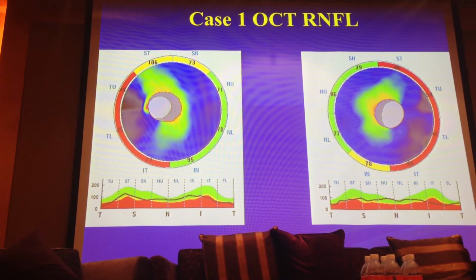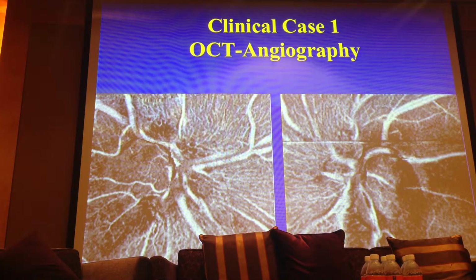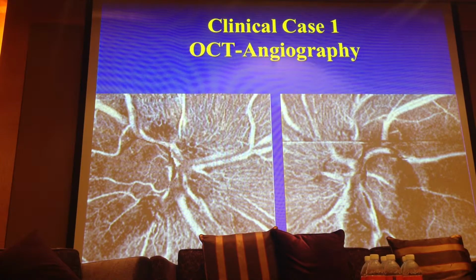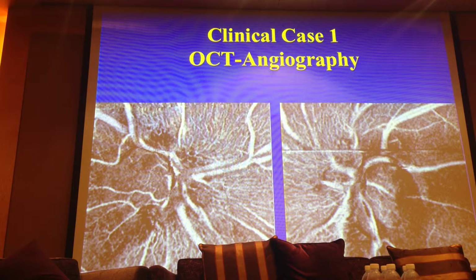It was this kind of case that shaped our approach to glaucoma, because when we made OCT angiography, we saw on both eyes this dramatic reduction of vascularization around the disc. Together with the other cases, it was evidence for us that we have to follow up this patient this way. Due to this new technology, it was a new way of thinking about glaucoma, and probably a return to a vascular analysis of glaucoma, and not only neuropathy of the optic disc.